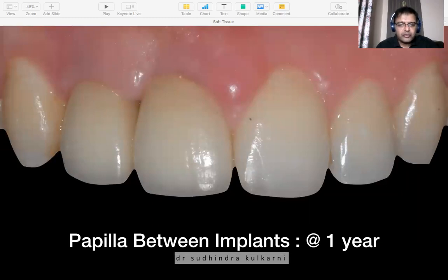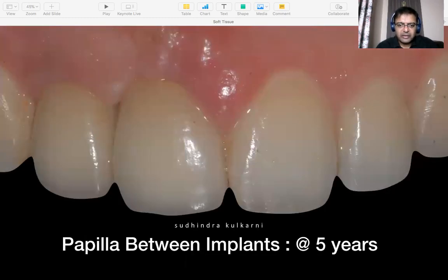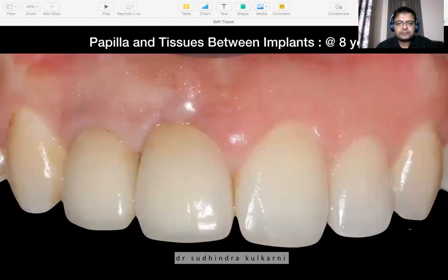So between the 2 crowns, between 1.1 and 1.2, you have papilla. There is some amount of soft tissue reduction at the end of 1 year. This is at 5 years. You see the tissue is good. It's stippled. It's got thick there. And this is at the end of 8 years. You see that the papilla, the tissue, everything looks nice and neat around these implants. And I'm hopeful that it would eventually hold up.